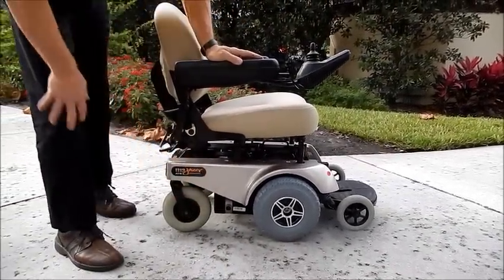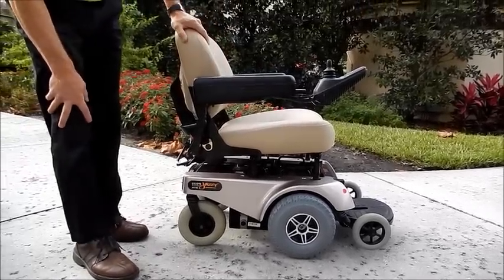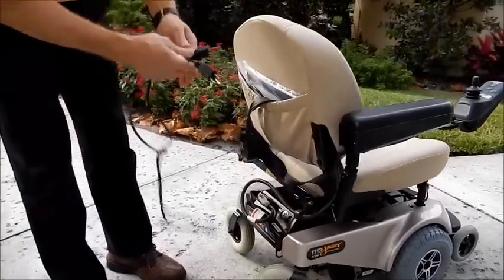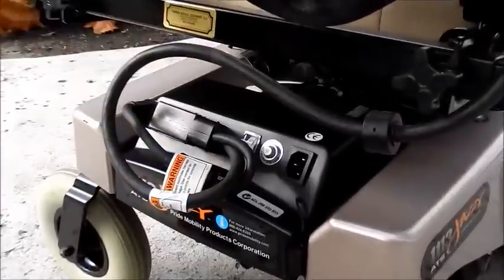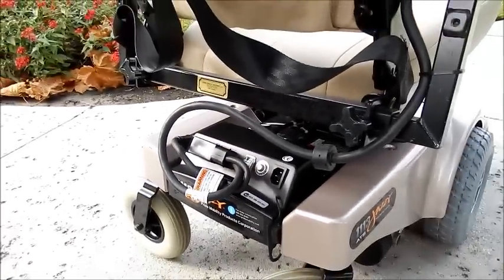These are direct drive motors. You can hardly hear them. This chair also has a nice vinyl seat and a built-in charger. All you have to do is take the cord, plug it into the charger, and plug the other half into the wall, and the charger will charge. Once it's full, it'll stop charging on its own.